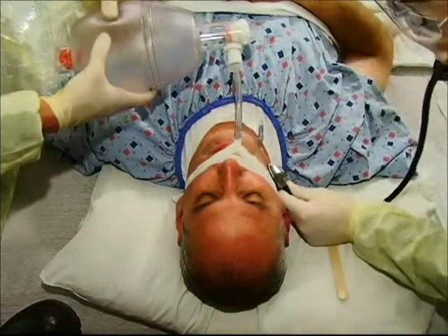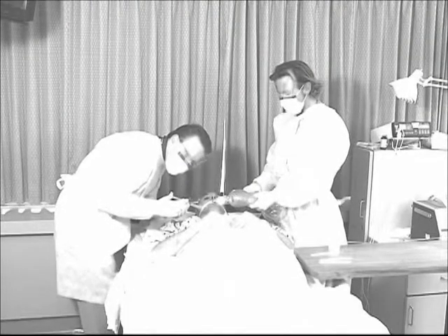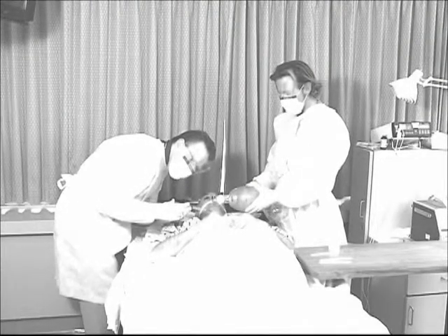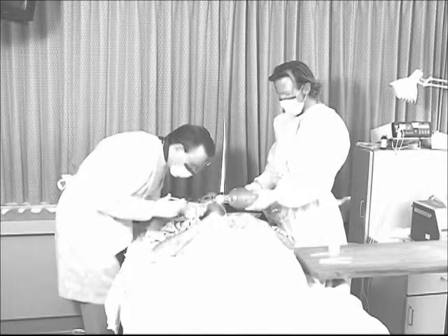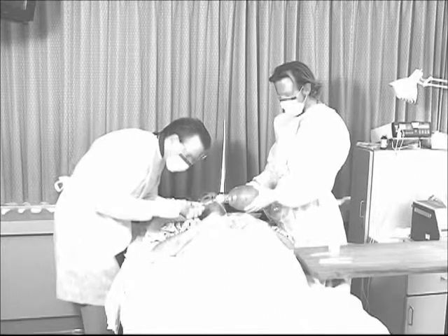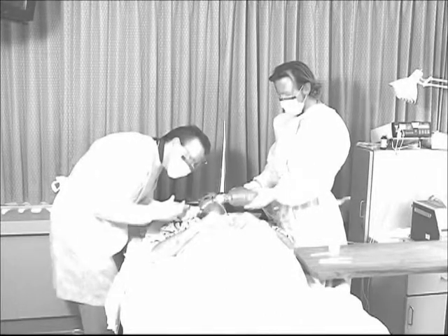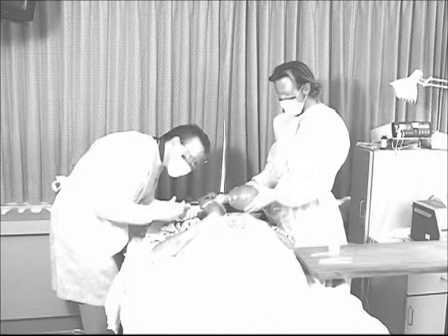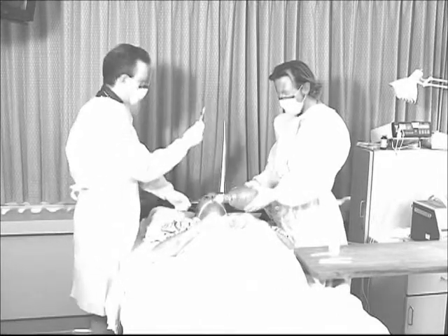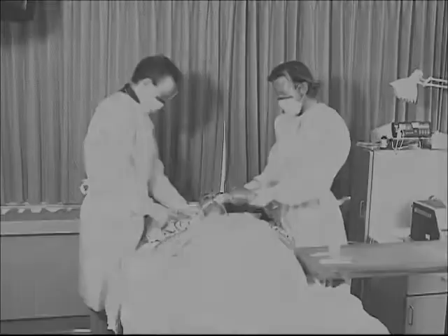Document the total amount of air injected to inflate the cuff. Both cuff inflation methods may be applied in nasal and oral endotracheal tubes as well as tracheostomy tubes. There is no variation in either method regardless of whether the patient is intubated with an oral, nasal, or tracheostomy tube. The determination of whether to use MOV or MLT is generally based on institutional or departmental policy; either method is acceptable in the majority of cases.